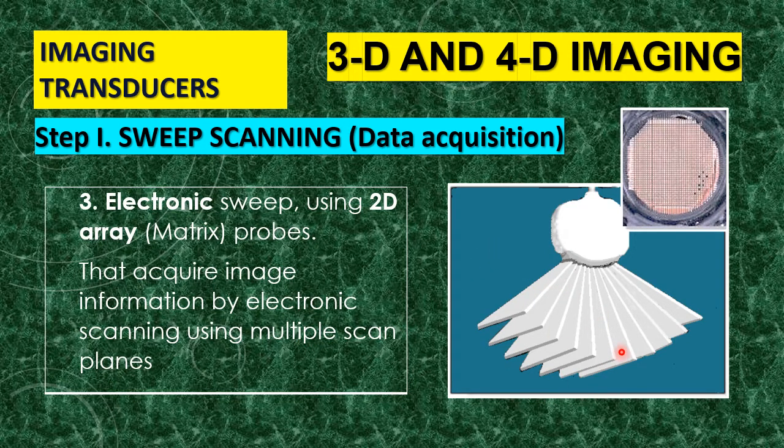So now the whole volume is almost scanned instantaneously from this end to this end, and will be processed later on almost simultaneously with this high technology machine.